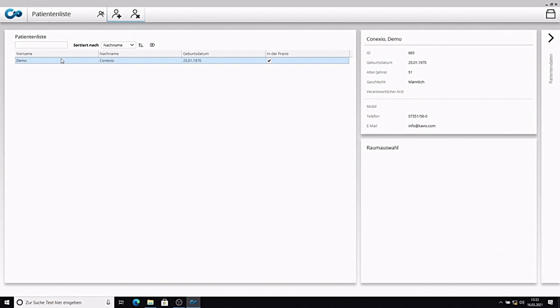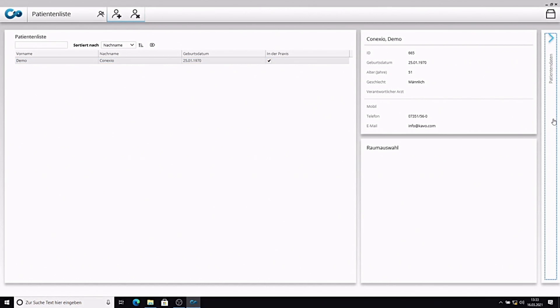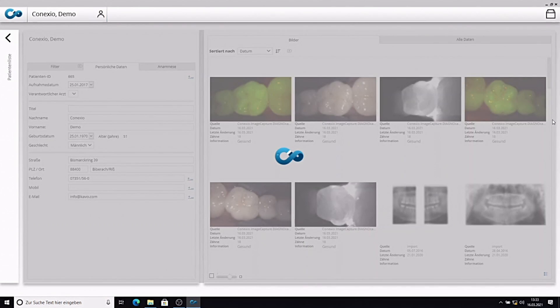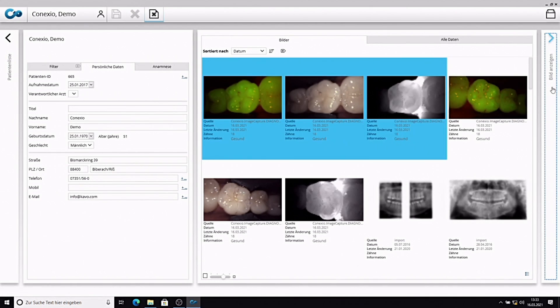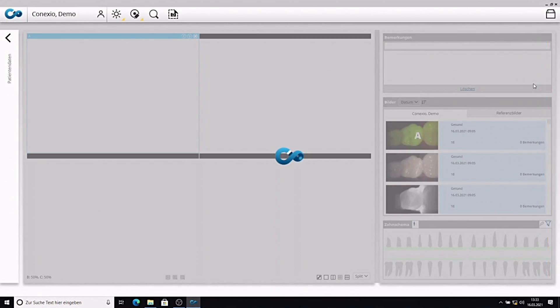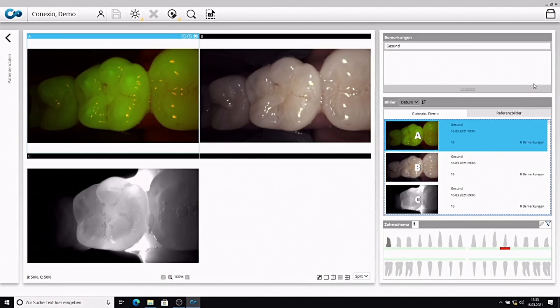The CAWO Connexio software has a modular structure and consists of three different levels. Level 1, Patient List, displays a list of all available patients. Level 2, Patient File, displays all available images of the patient. Level 3, Image Display, displays all selected images.